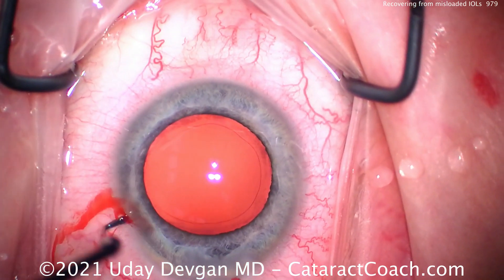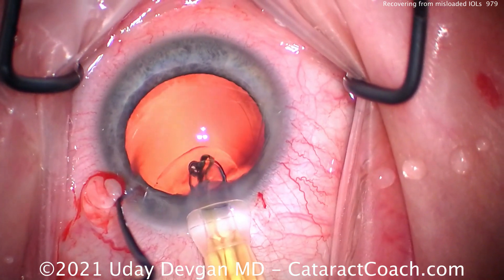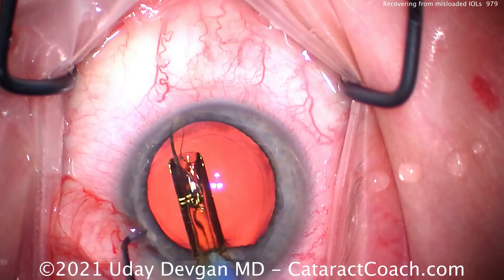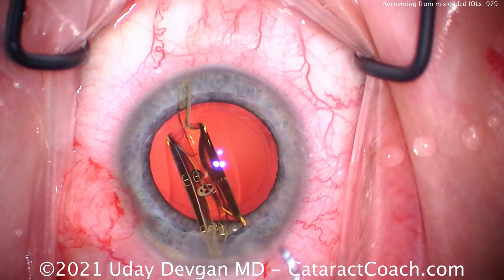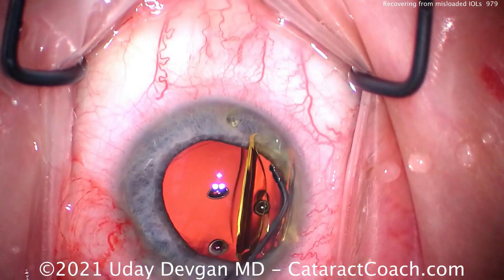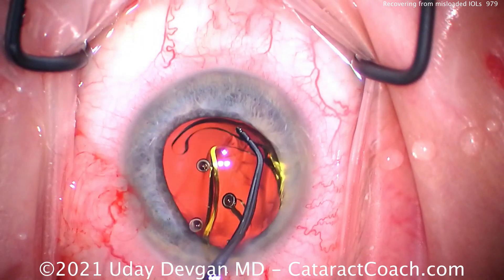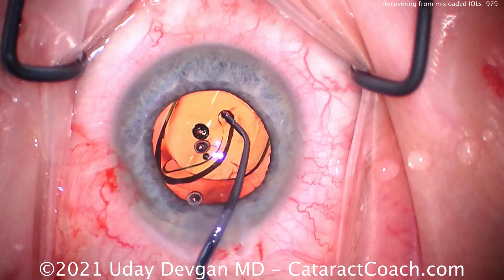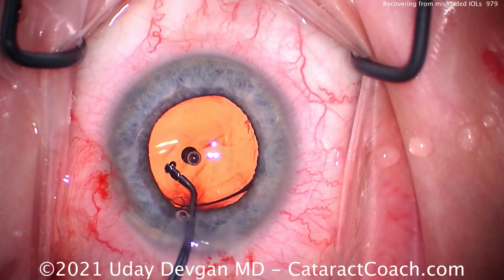This time the scrub tech said the leading haptic isn't quite folded over. So as it comes out, I think — which way does it turn? Let's put the whole IOL in the anterior chamber. I want the haptics on top of the iris, because that's going to allow me to get this in the correct orientation. I don't want to push it into the bag and have this haptic pulling on that thin posterior capsule. So I'd rather start it higher in the eye, in the anterior chamber on top of the iris, and that's going to allow me to get those haptics in an appropriate position.